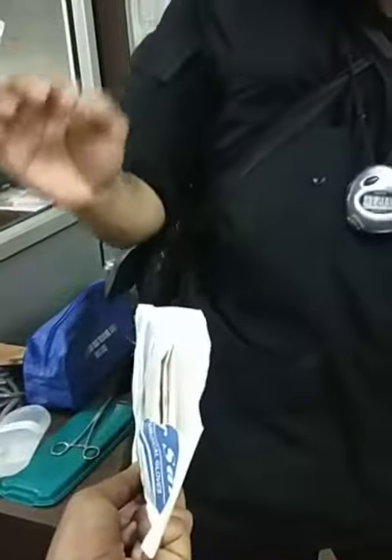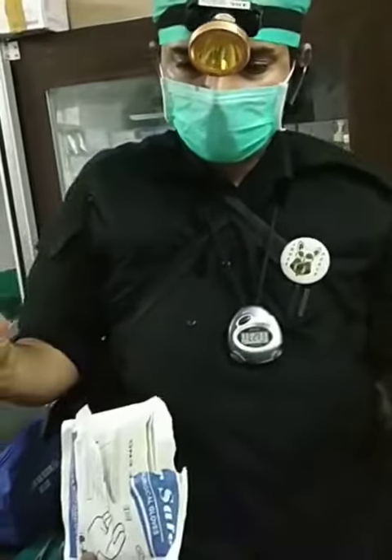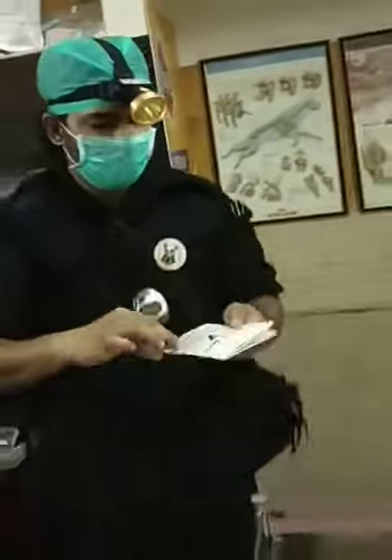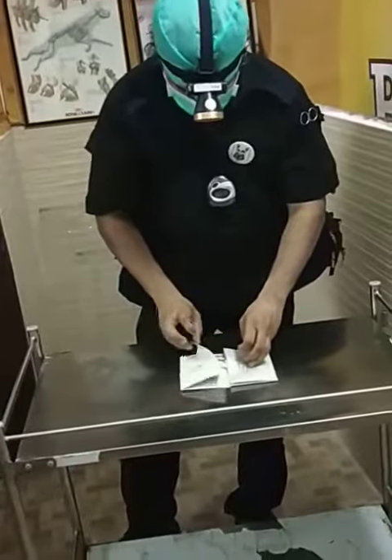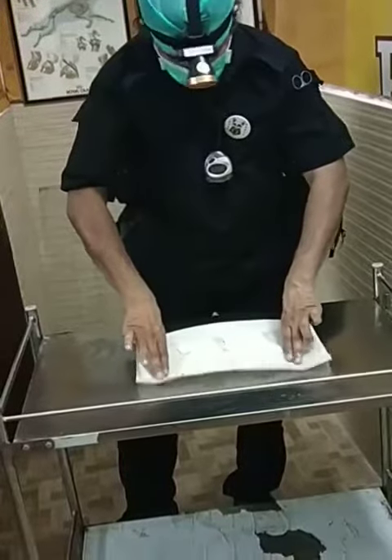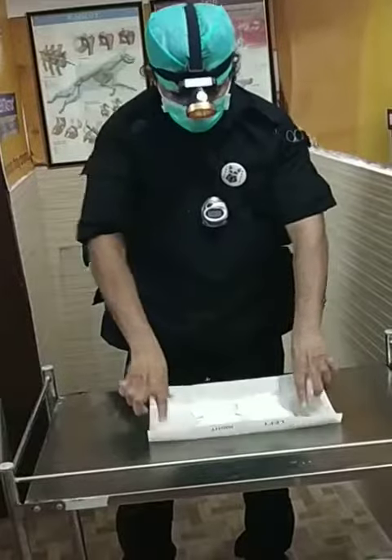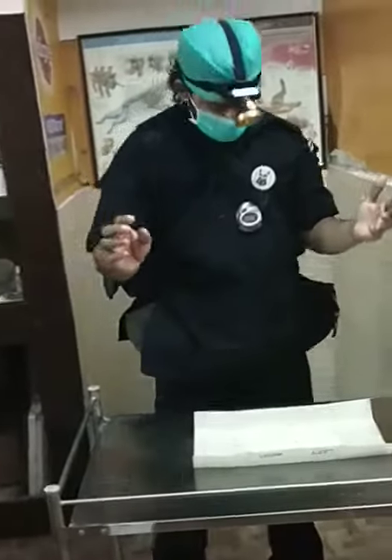Now the glove wrapper. This has already been torn open just for the sake of understanding, because I have an assistant who is holding the camera. It has been torn by an assistant in such a way that he doesn't touch inside. You want to make sure that all the doors, windows, fans, and ACs, if there are any, have to be off — otherwise the glove is going to fly away, and your sepsis is going to go really bad. So I open up, press this line so that it doesn't go bad. I don't touch the table, I don't touch the glass. I just place my fingers on the wrapper. If you're a right-handed surgeon, it's easy to wear the left-hand glove first.